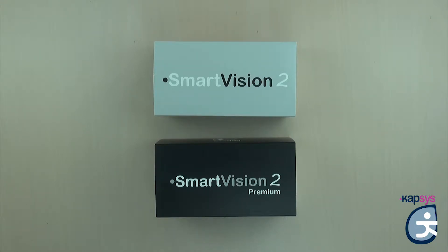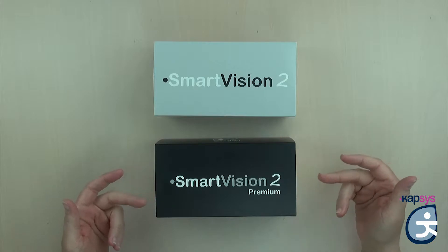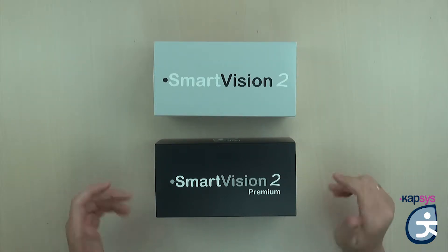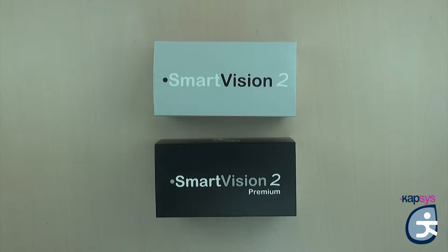The Smart Vision 2 by Kapsys comes in two versions: the Smart Vision 2 and the Smart Vision 2 Premium. The difference between these two versions is uniquely based on their applications. Smart Vision 2 Premium offers three additional embedded applications. The first is Kapten GPS, a pedestrian and car GPS navigator for the blind and visually impaired, with online downloadable maps and offline navigation.